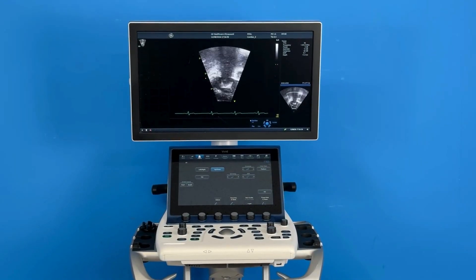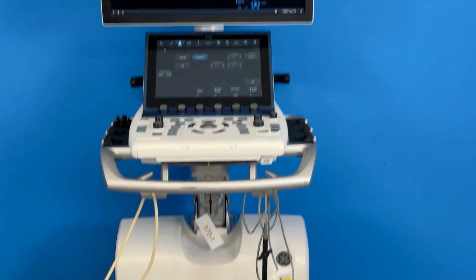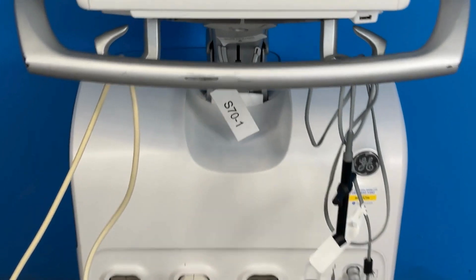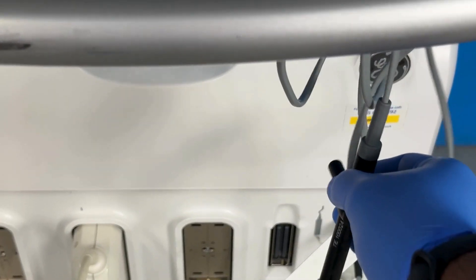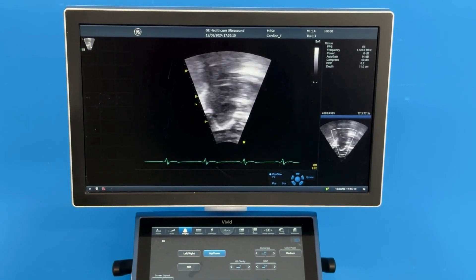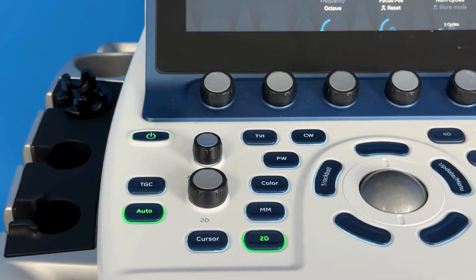Hello guys, welcome to Medical UK. Today we have the ultrasound GE Vivid S70-1 model with M5SCD Pro and P2D TE10024 Pro probes. Here is the M5SCD Pro.